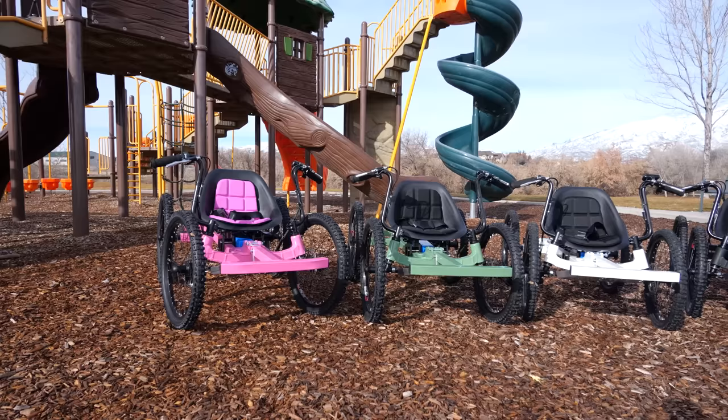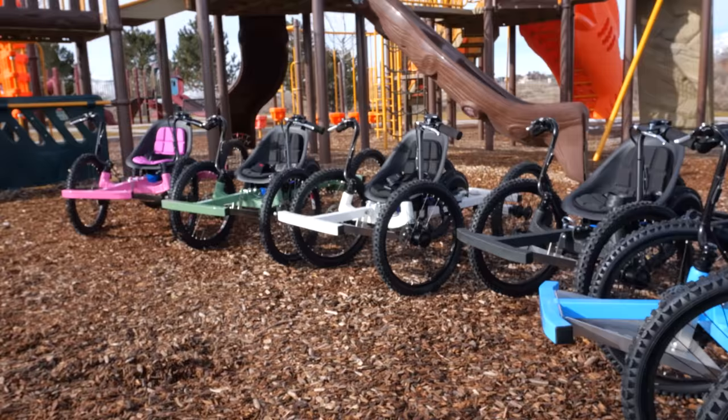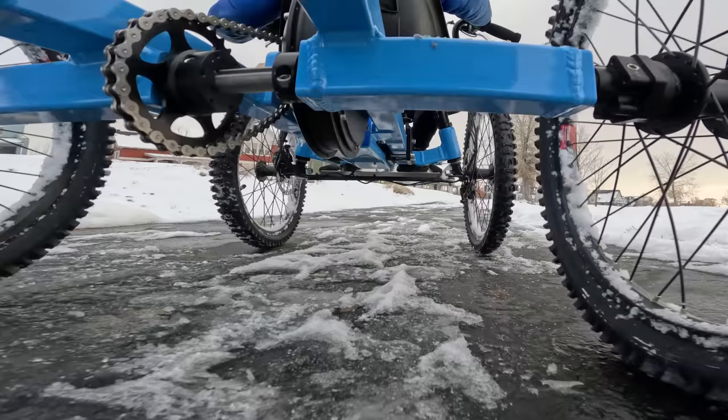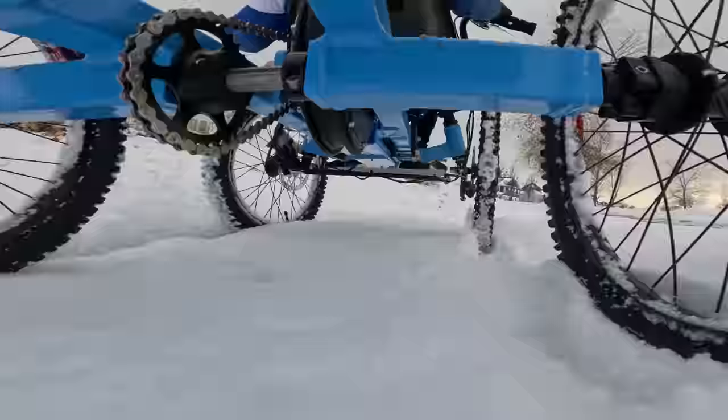Let me show you our latest project from Not A Wheelchair. We call it the Kid Rig. The biggest request we've had since releasing our adult-sized full version of the rig back in 2020 has been to create a kid-sized version of that. So we did. We found that off-road wheelchairs are incredibly expensive and for kids basically non-existent, so we're hoping our Not A Wheelchair Kid Rig can help fill that gap.